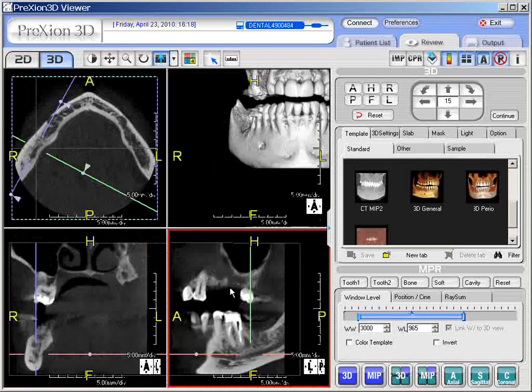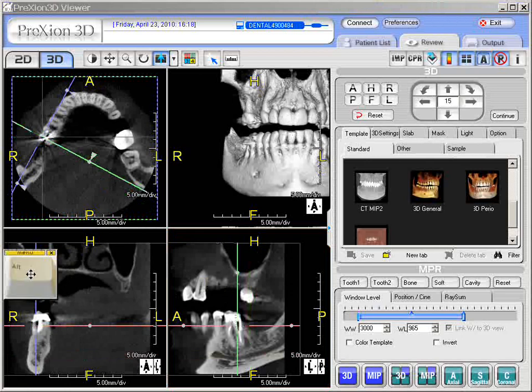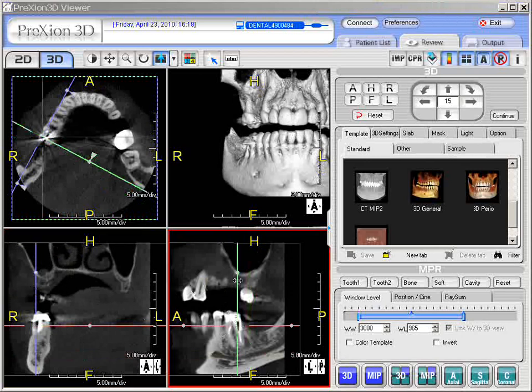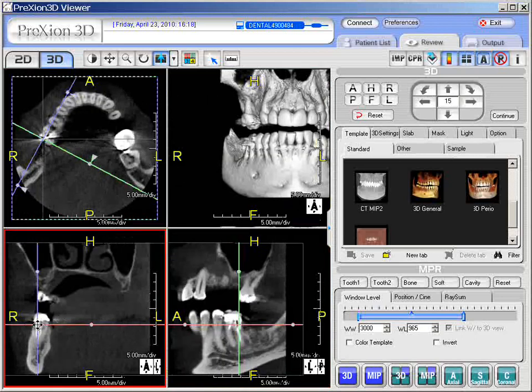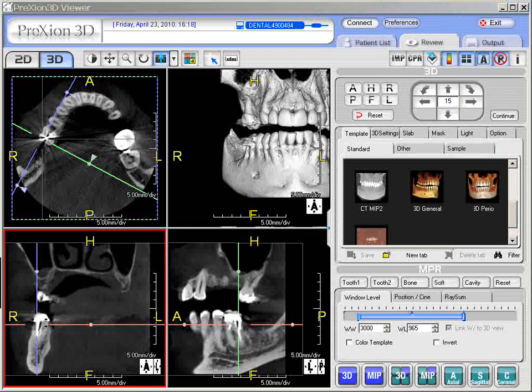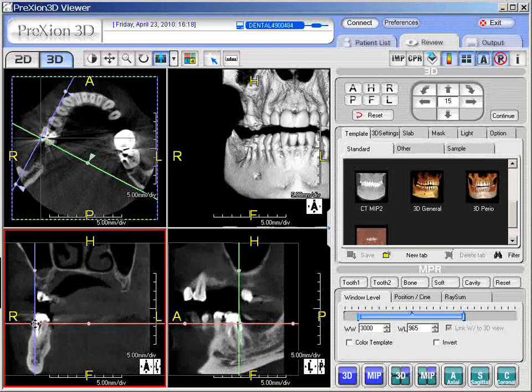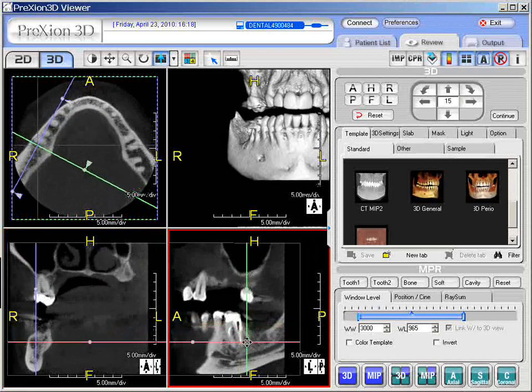You can be in any location to do this. If you wish to evaluate a particular tooth, simply press the ALT key and click in a particular location. You can then evaluate at that same location, or use your anchor point and double-click any of the other views. Wherever the crosshairs meet is where you are in all three planes — axial, coronal, and sagittal — to evaluate any area of concern.